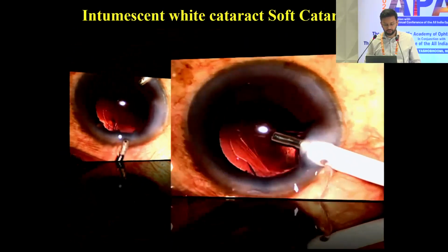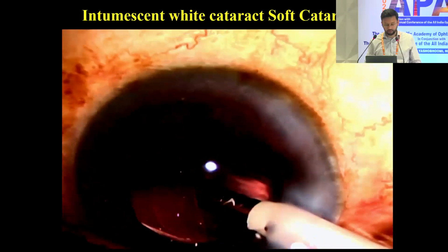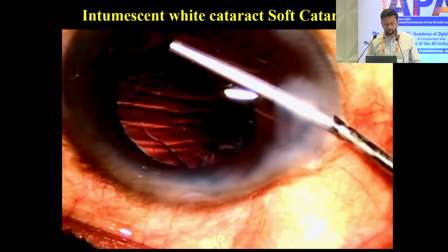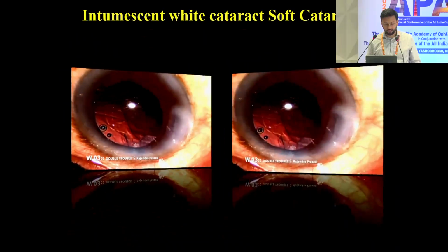Without much loss into the vitreous. We ensure there is no more vitreous around the tear, above the iris, and near the ports. So we cut from posterior to anterior, and then forming the anterior chamber again, we were able to place the IOL here.